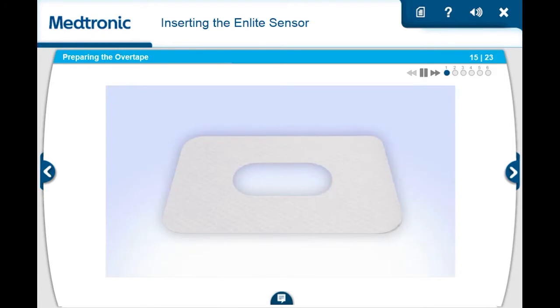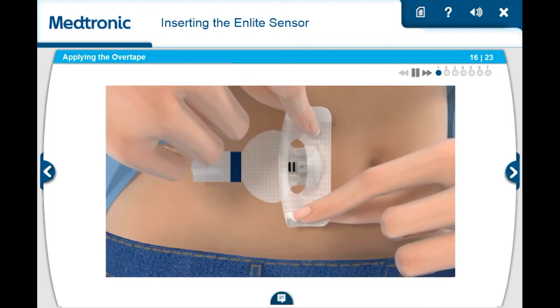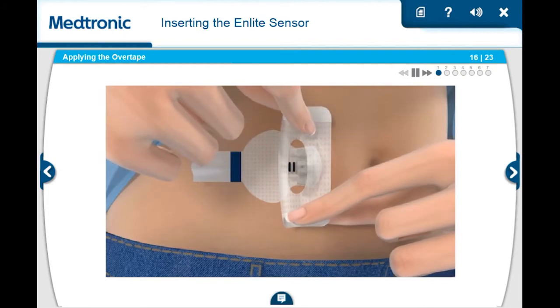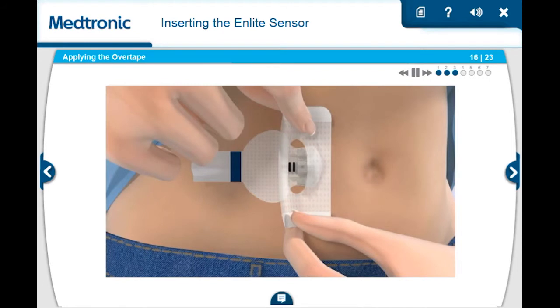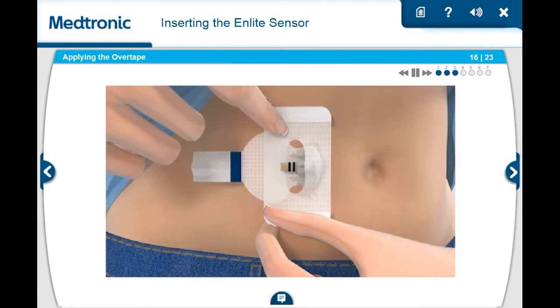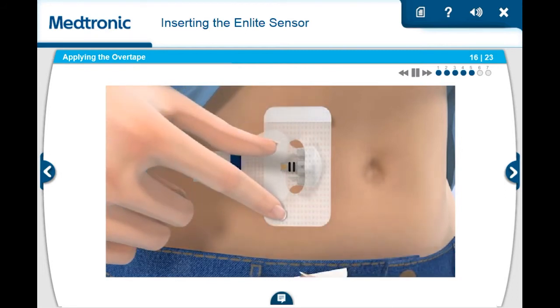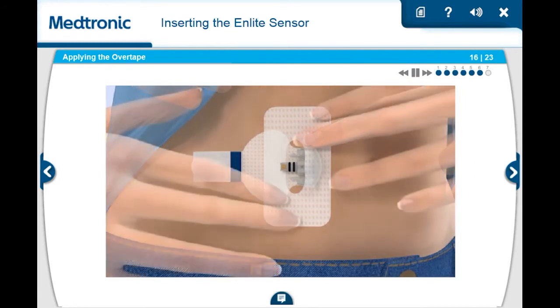Next, you will need to apply the overtape. Because the sensor is small, it is important that you apply the overtape that came with the sensor. Hold the overtape by the covered ends and apply one side of the overtape so that it covers both the round part of the sensor and the skin securely. Make sure the tape is covering both the skin and the sensor. Then, stretch the remaining part of the overtape around the sensor connector so that it sticks to the adhesive pad but does not block the sensor connector. Smooth down the tape that was placed on the skin. Then, remove the two paper tabs marked with the number 2 from the sides of the overtape. Press the remaining overtape against the skin.